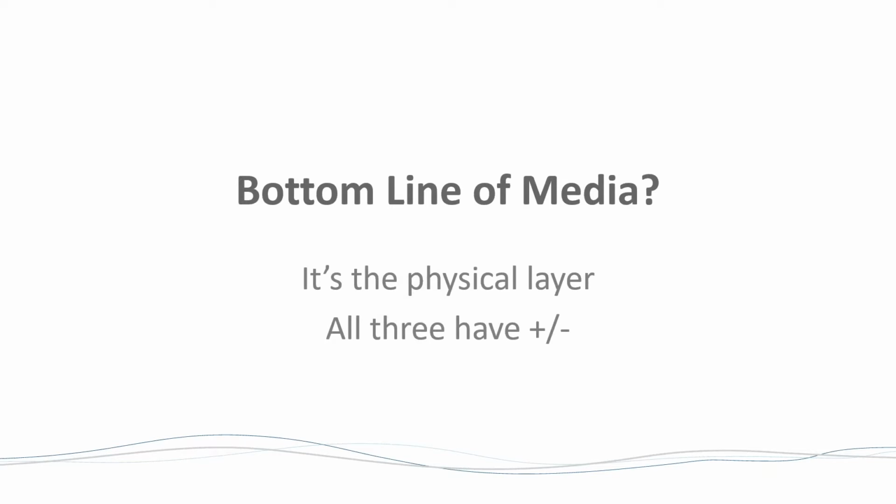Okay, bottom line of media, it's the physical layer. All the different media types have pluses and minuses. That layer 1 is just focusing on the physical connection between devices, okay? Voltages.